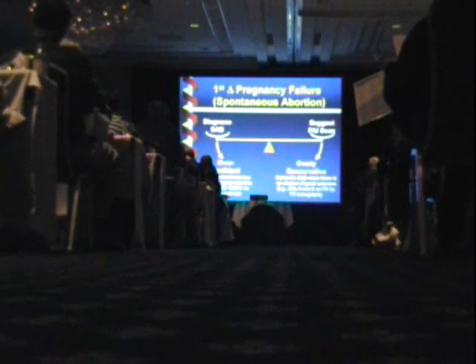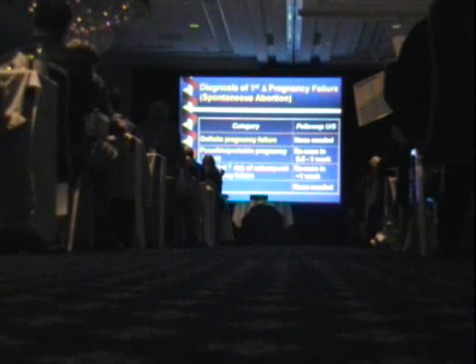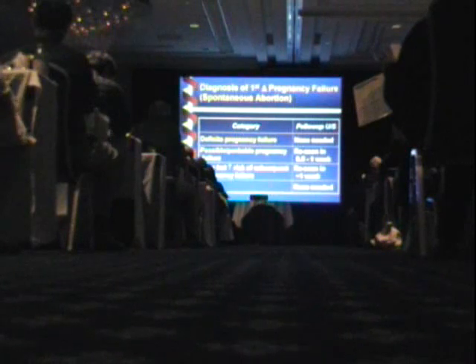So how do you make that careful balance? Not to call it when you shouldn't, but not failing to call it when you should. Well, we'll get into it in a minute. Basically, when we do an early ultrasound for problems, the goal is, and this is early on, to put the findings into one of 4 categories.